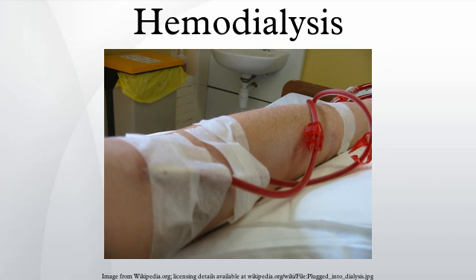Dialyzer membranes used to be made primarily of cellulose. The surface of such membranes was not very biocompatible, because exposed hydroxyl groups would activate complement in the blood passing by the membrane. Therefore, the basic, unsubstituted cellulose membrane was modified. One change was to cover these hydroxyl groups with acetate groups.